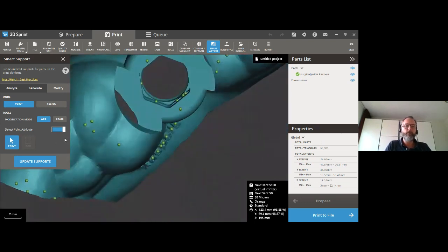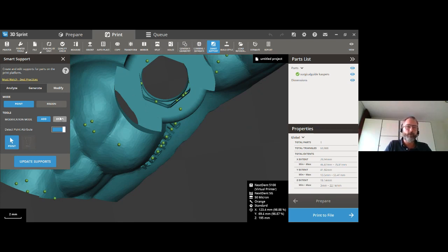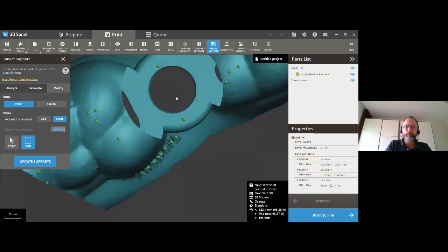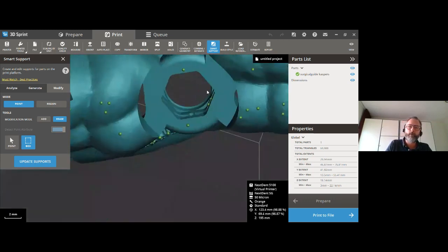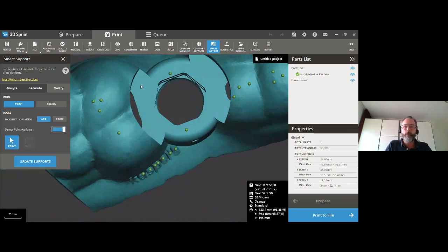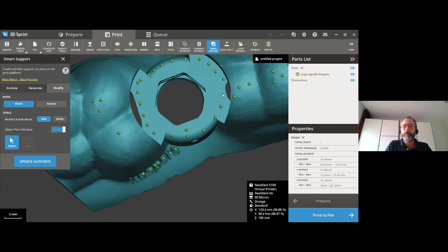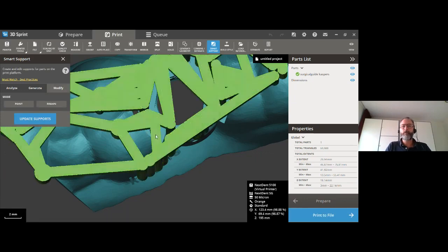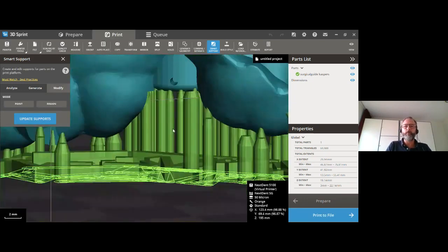Sometimes supports are placed where you don't want them — for example, here the software generated supports inside the surgical guide sleeve, which is not ideal. Smart Support calculates placement purely from a 3D printing point of view, not from a dental perspective. So you need to be aware of this, especially with surgical guides. We need to get rid of those inside supports. Rather than erasing, we use the box selection to remove the unwanted supports, then add supports along the outside. Click Update Supports and now all supports are in place but no longer inside the sleeve.